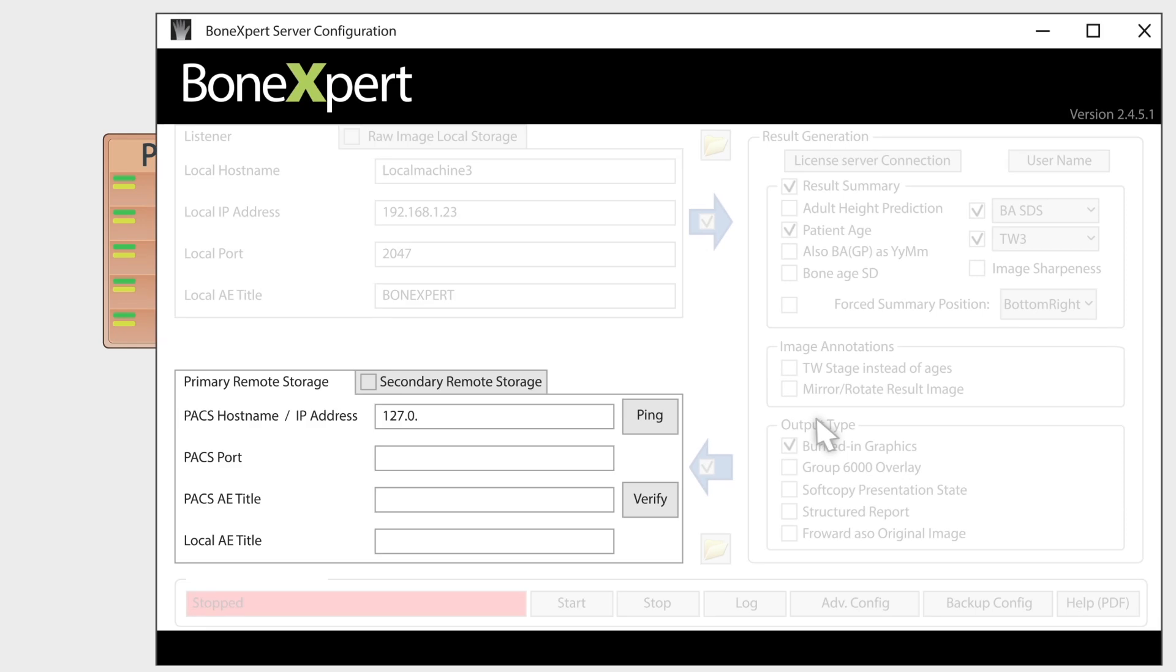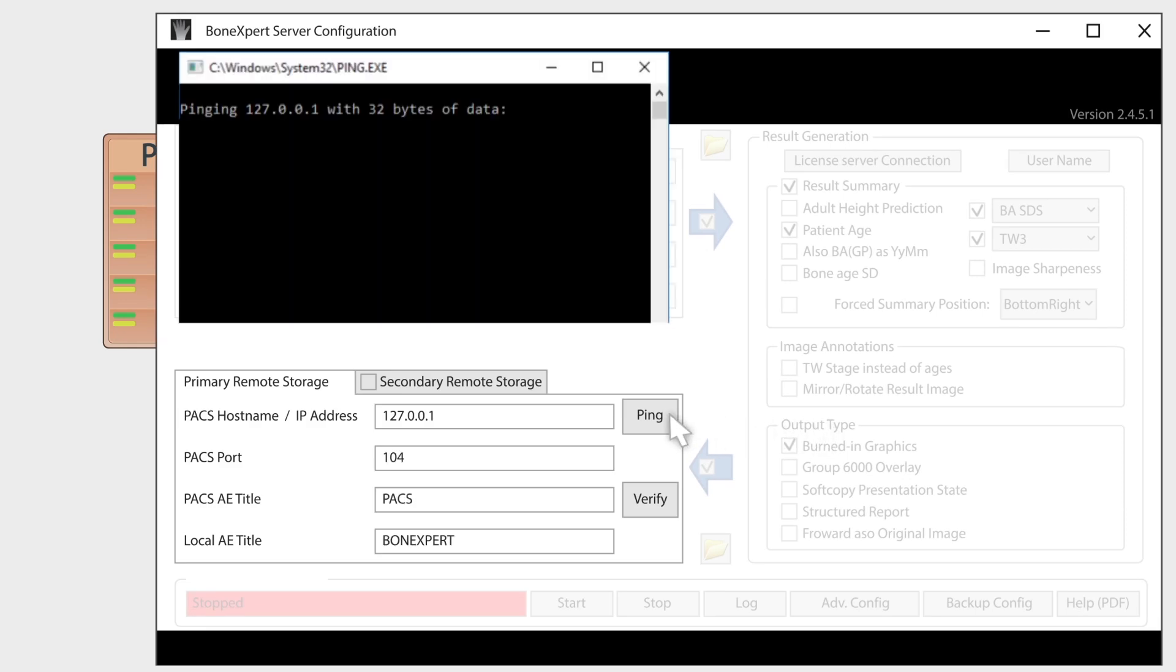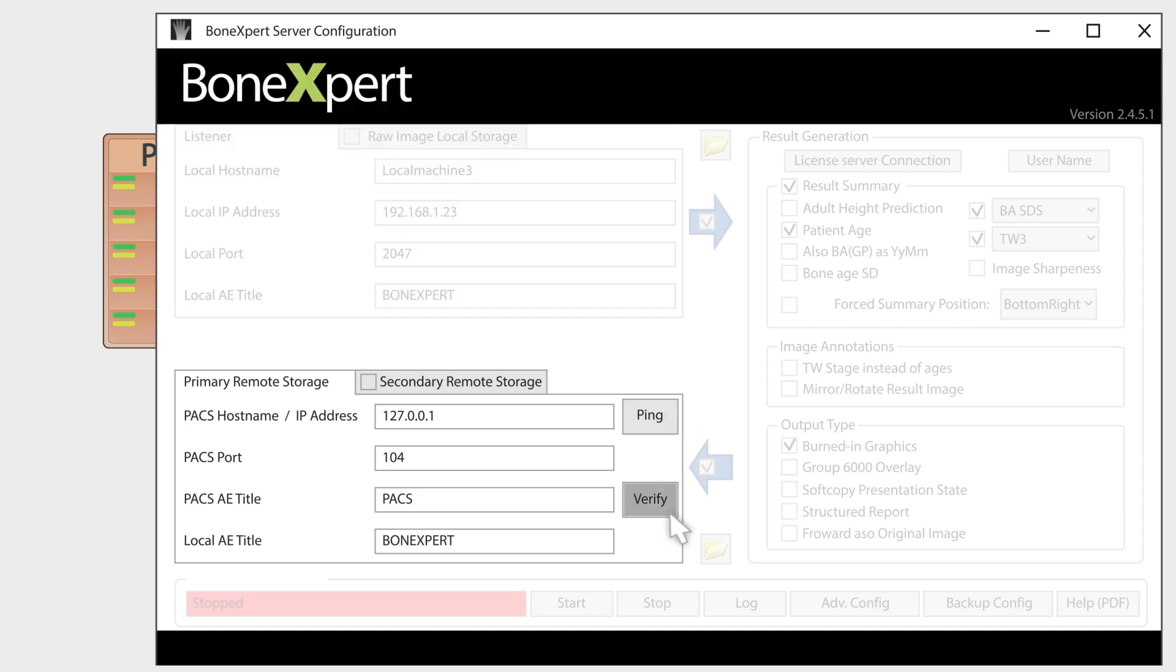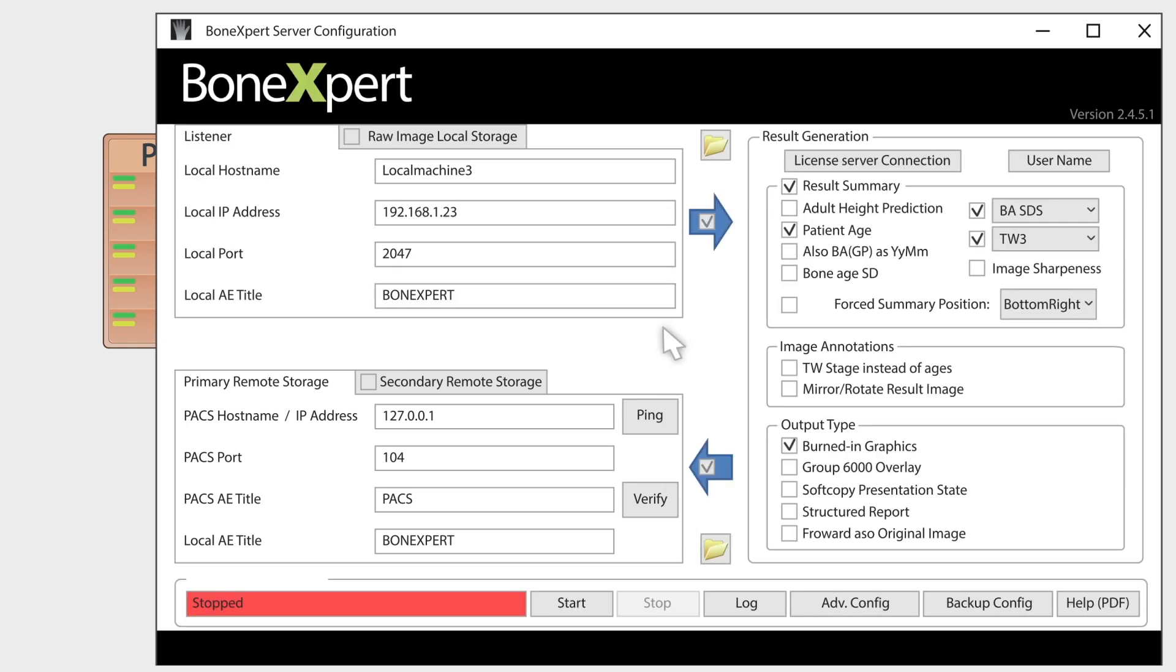Finally, configure BoneXpert to return annotated images to PACS. Verify the connection from BoneXpert with a ping and a C-echo. That's all. Just start the service.